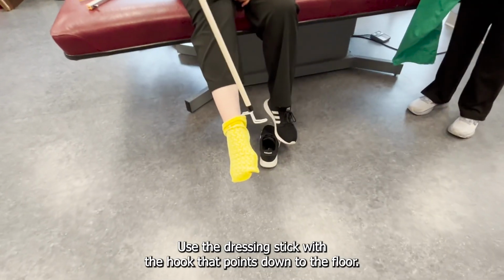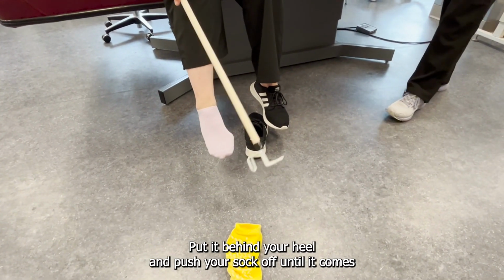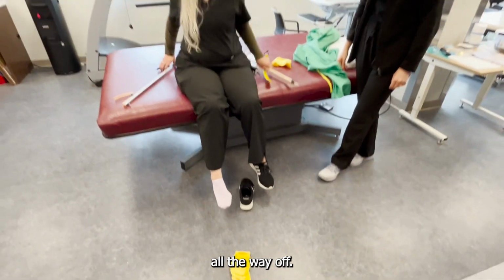Use the dressing stick with the hook that points down to the floor, put it behind your heel and push your sock off until it comes all the way off.